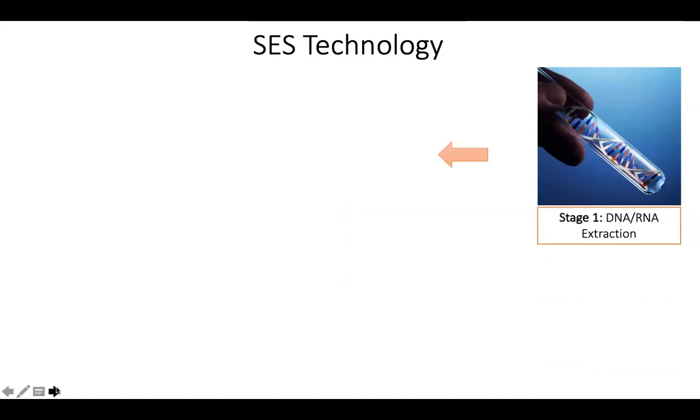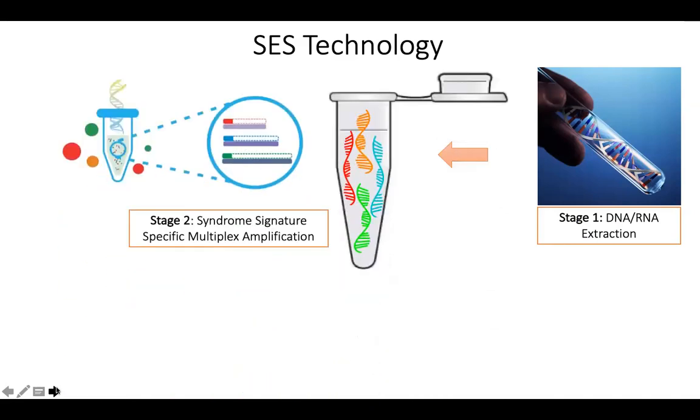We actually prepare the DNA and RNA from a sample. We extract that out, and if it is RNA, we convert it into cDNA. Then for all DNA and RNA, we do a multiplex amplification, in which anywhere from 11 genes to nearly 29 genes are tested in a single sample in a single tube. So we amplify for all of them. Something got amplified, but in this small 50 microliter volume, you wouldn't know what got amplified.